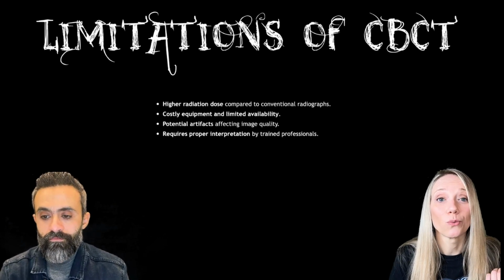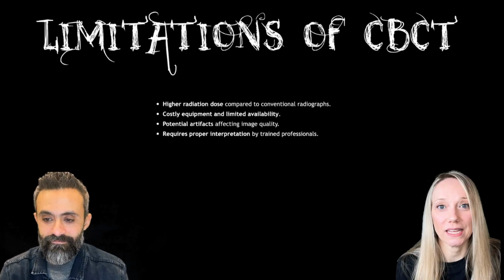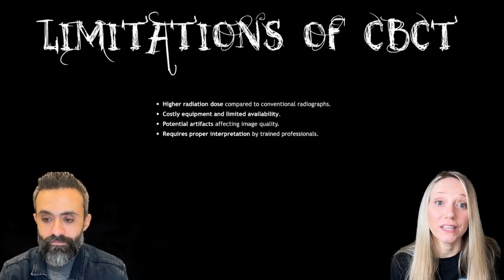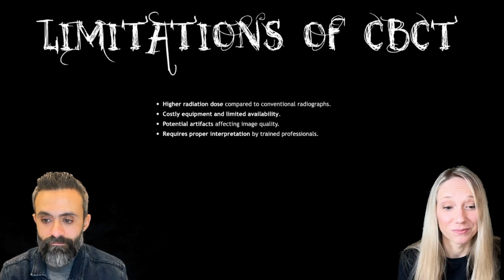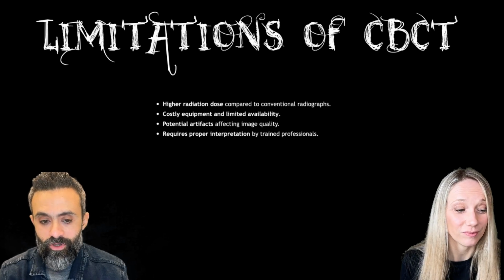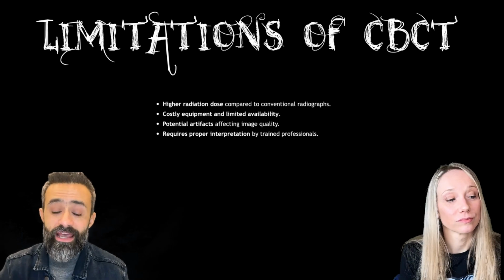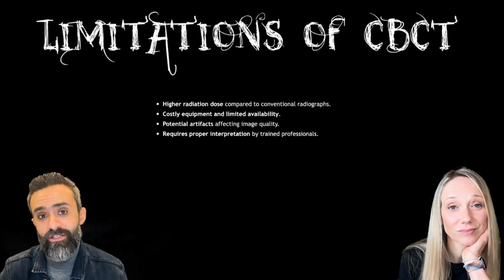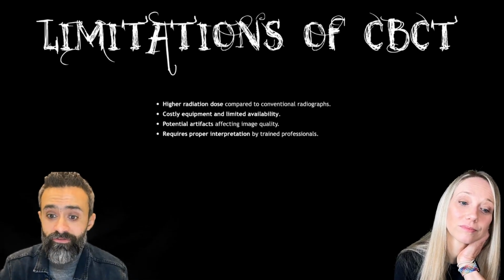And then, of course, we need to be able to read the CBCT. So we have to study a bit and get used to that kind of image in order to be able to get all the information that is there for us, but we need to know how if we want to see it. Yes, that was a good brief about the benefits and the limitations. We cannot say disadvantages because it provides us with a lot of advantages, but it can somehow be a limitation. And a limitation can be solved in the future. We don't know.